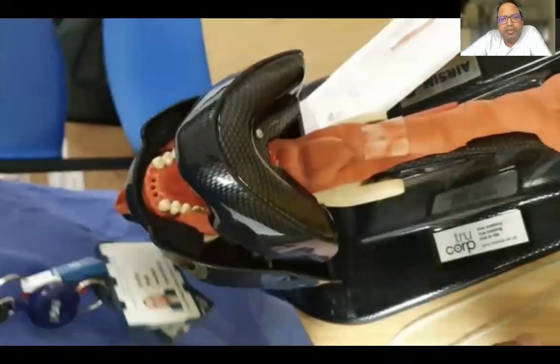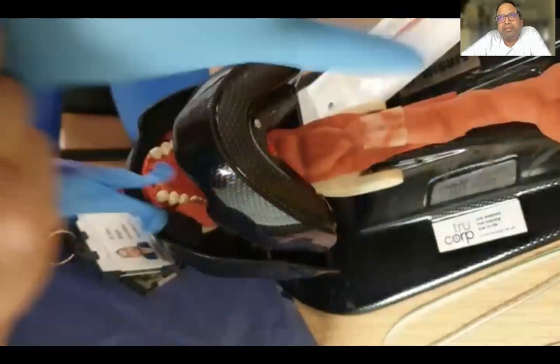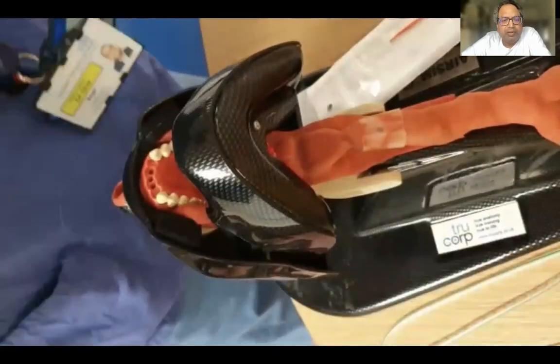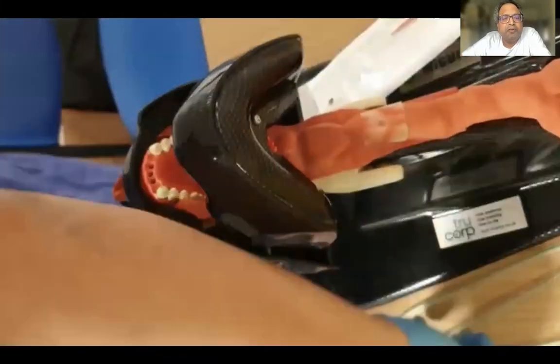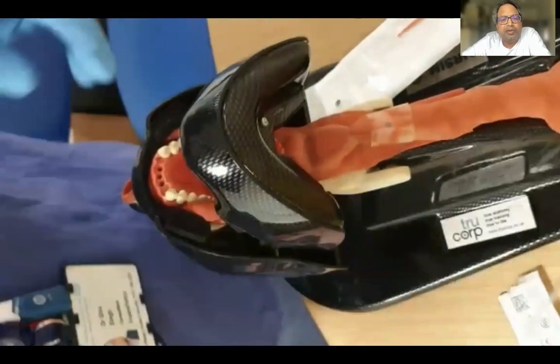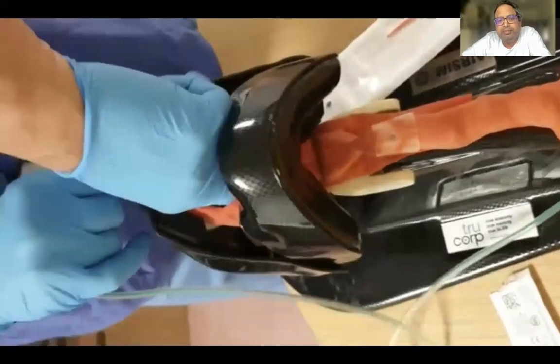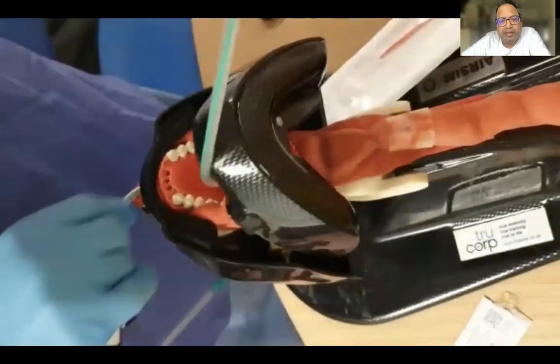You can use any size tube. A size 7 endotracheal tube will probably allow most of the NG tube sizes through it. So you can use any size NG tube through them. You need to jelly the tube really well for inserting through the nose as well as bringing it out through the mouth. So put a liberal amount of water-based gel, insert it through the nose and bring it out through the mouth. In most cases, when you're pushing the NG tube, it goes fine. If it doesn't, it coils in the mouth, so you can just put your finger in and take it out from the mouth.